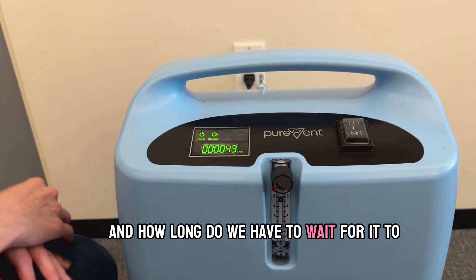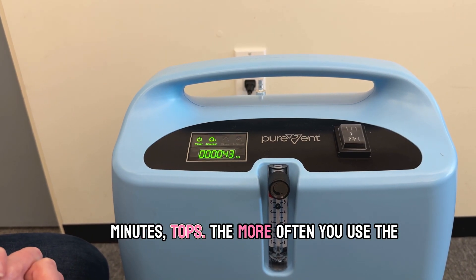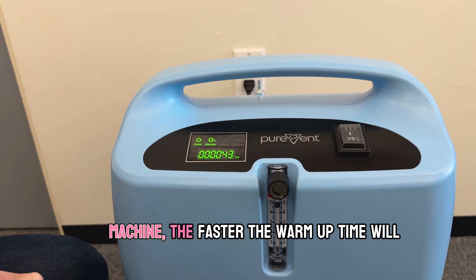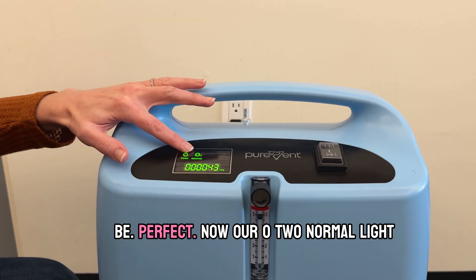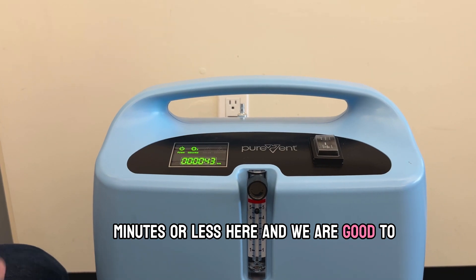How long do we have to wait for it to warm up? Usually warm-up time is about two to three minutes tops. The more often you use the machine the faster the warm-up time will be. Our O2 normal light has stayed illuminated — about two minutes or less here and we are good to go.